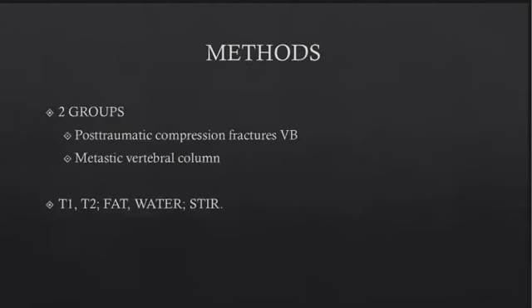In this prospective study, patients were separated into two groups. One, a group of post-traumatic compression fractures of vertebral bodies composed of 26 patients, and two, a group composed of 27 patients who had metastatic disease to the vertebral column. T1 and T2 images with pre-saturation pulse sequences to suppress either fat or water signal were obtained, in addition to a STIR sequence.